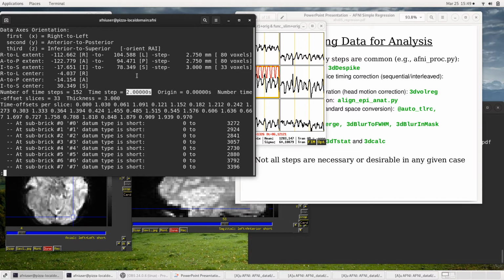For example, if you've got some stimulus where you play some sounds for the subjects and they have to verbally respond, maybe you'll have a 2-second volume acquisition followed by 4 seconds of time where the subject is allowed to talk, and then another 2-second volume acquisition.